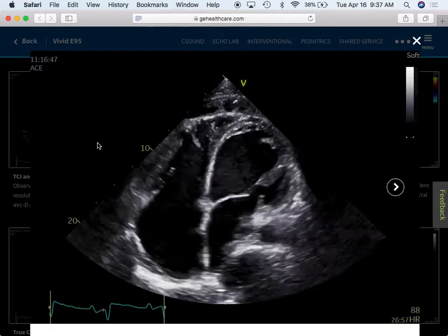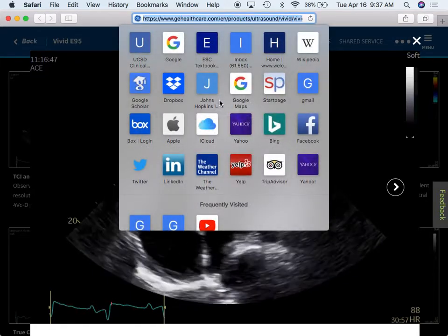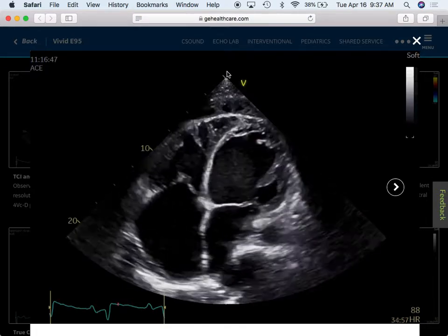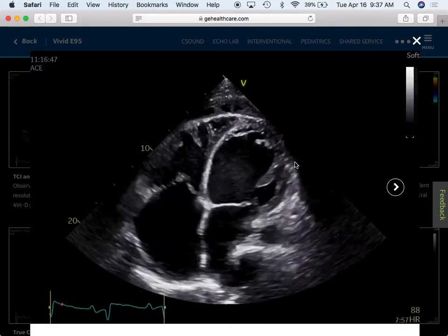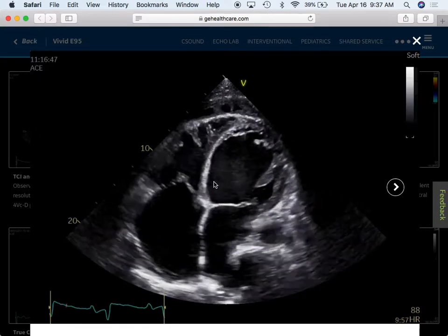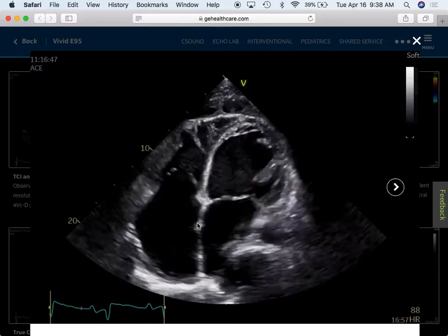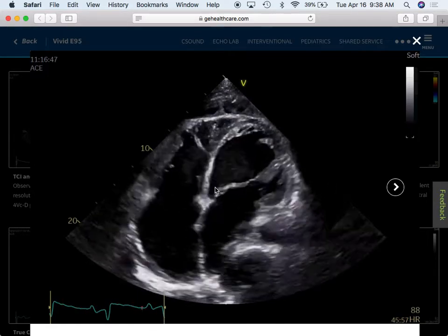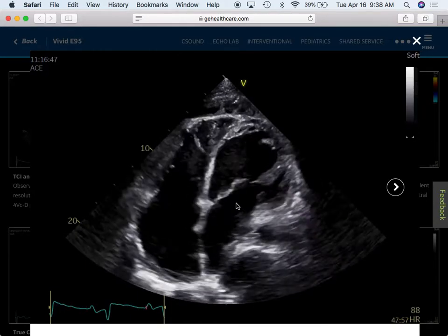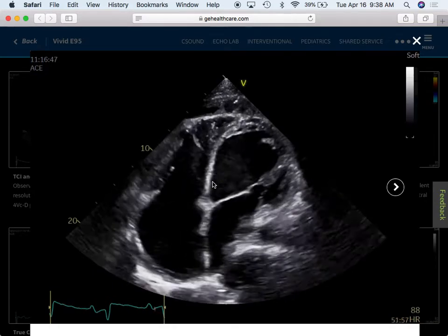Okay, so it's up at the top here. It's shooting sound into the patient through their chest wall, which is right here, and their heart is just under their ribs. And as you can see, it looks sort of like an edge image. There is little signal inside the cardiac chamber itself, but there's a lot of signal off edges, like this valve here. The heart wall itself shows a bright signal.